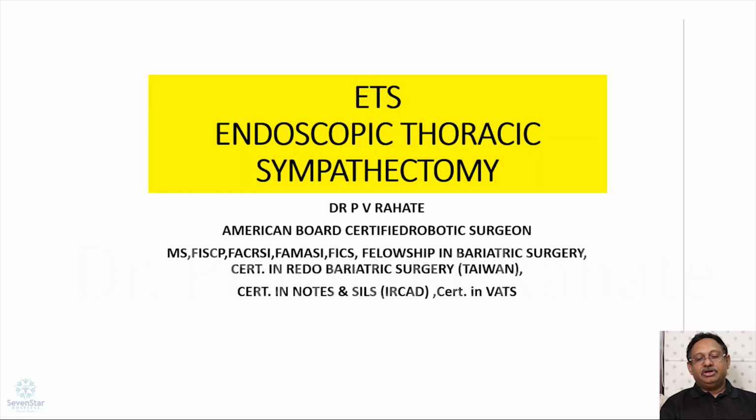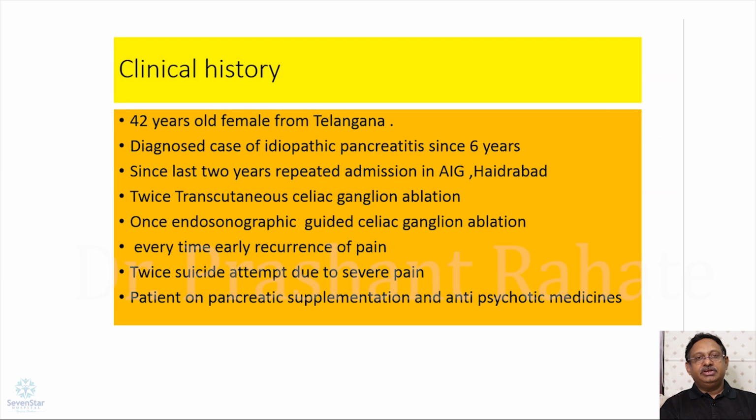Hello everybody. Today we will see the endoscopic thoracic sympathectomy or ETS, how it is done, what are the indications and what are the complications. Clinically we will see one scenario and then we will discuss.